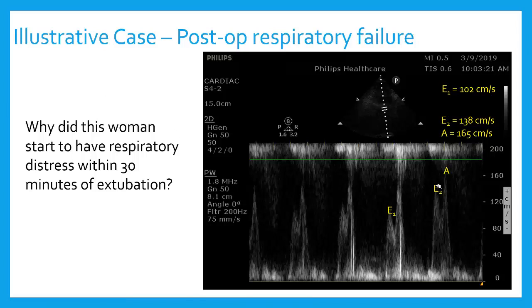The reason this woman went into respiratory failure is because she has severe diastolic dysfunction. This machine didn't have tissue Doppler enabled, so I was stuck just looking at mitral inflow velocities and couldn't get my E-prime. But I can tell my E to A is just about 0.8, so this woman probably has grade 2 diastolic dysfunction. Her E-prime is 10, which for a 71-year-old would be decent, but her E to E-prime is going to be over 13. There are also widely variable E-velocities — those are just huge intrathoracic pressure swings from her work of breathing. She was really huffing and puffing. You might see similar variation in tamponade, but this is from severe elevations in work of breathing.